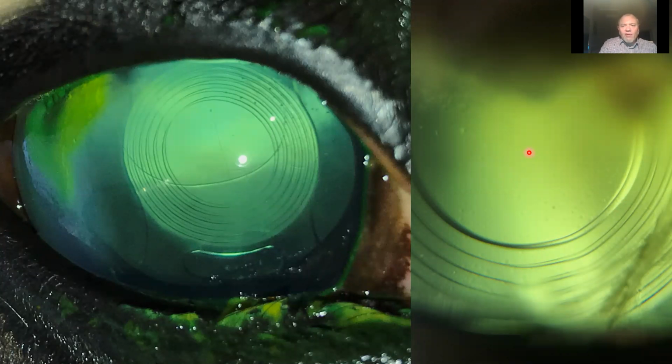Same eye again, using our iPhones, distant direct. Different case actually, but similar pathology. We're using our iPhones with the light turned on, zooming in to fill the screen, and actually allowing us to get this beautiful image to highlight the intraocular lens. You can actually see the anterior lens capsule tear here. This is another perforation which we made into a small capsulorhexis to place the artificial lens. And then using our macro lens, we can actually look at the IOL itself, the intraocular lens, and see individual cells starting to aggregate on the back of the IOL.